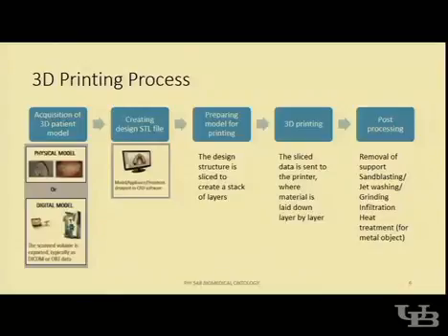That is the language that the machine is able to understand to do the process. All of this is done or designed in the CAD software. Once they have the design file, they will prepare the model for printing, where they need to structure the model in terms of the layers. How many layers? Because we are talking about building the 3D object layer by layer.